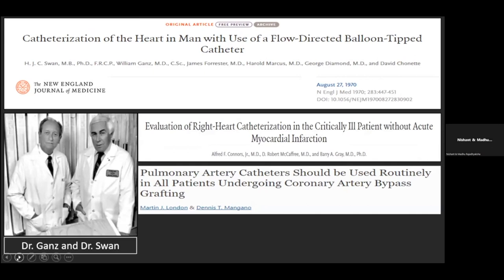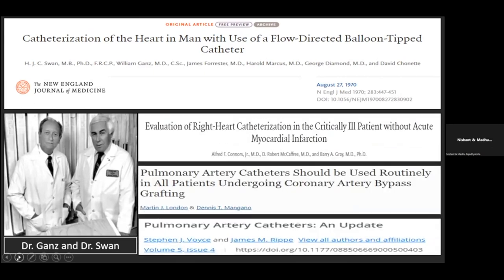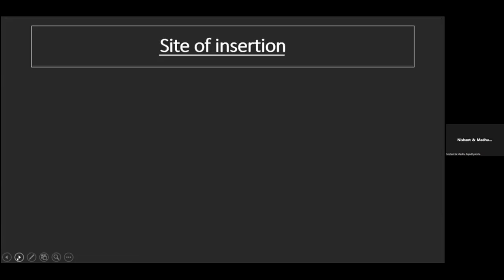In the same year, Waller and Kaplan demonstrated that a group of experienced cardiologists and surgeons who were blinded to the information from pulmonary artery catheter were unaware of the problems during 65% of severe hemodynamic abnormalities. Similarly, Iberti and Fisher showed 60% of ICU physicians made at least one change in the therapy, and 33% changed their diagnosis based on the pulmonary artery catheter data or PAC data. Thus, the introduction of flow-directed pulmonary artery catheter was a quantum advance in the monitoring of patients in the perioperative period during the 1970s and 80s.